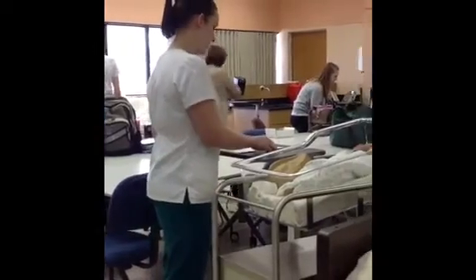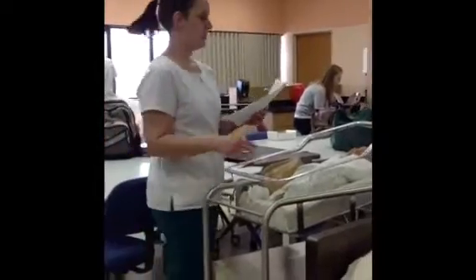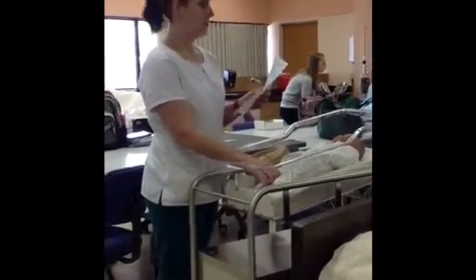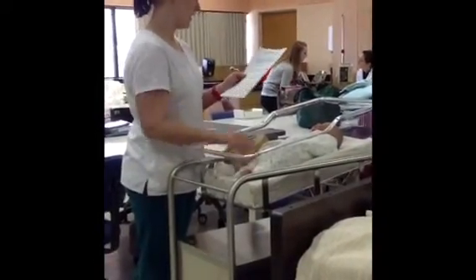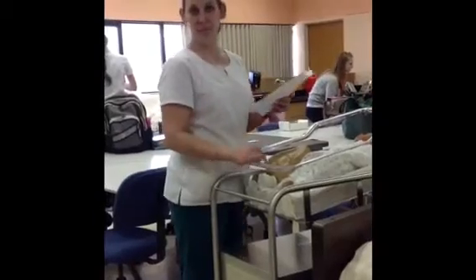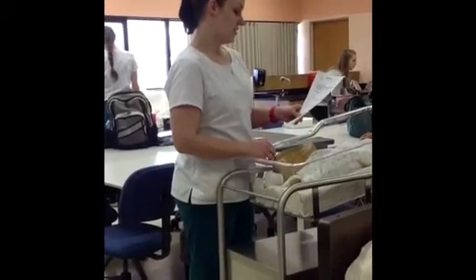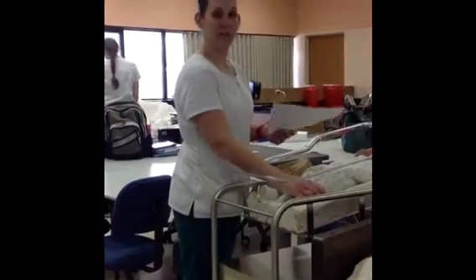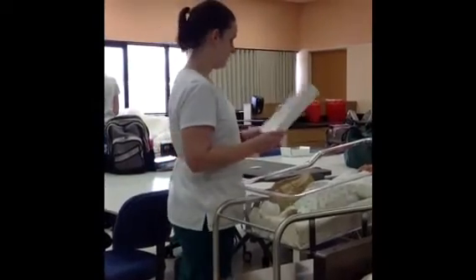I'm going to double check again, checking the baby's band and the parents' band, making sure everybody has the right name, Allison Alvarez, and I would have them verify the full name and date of birth. 1/1/13 is the date of birth. It's the right medication. I have the hepatitis B vaccine, 0.5 milliliters. The route will be intramuscular. The reason will be vaccination for hepatitis B. I have the open order from the doctor and the signed consent. So all my rights are checked out. Everything is ready to go.